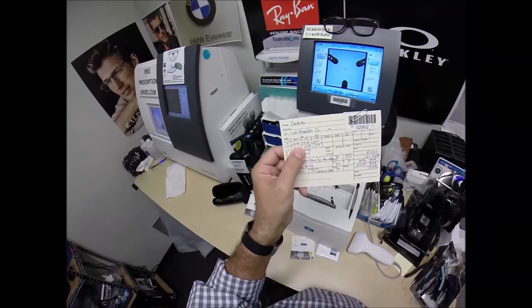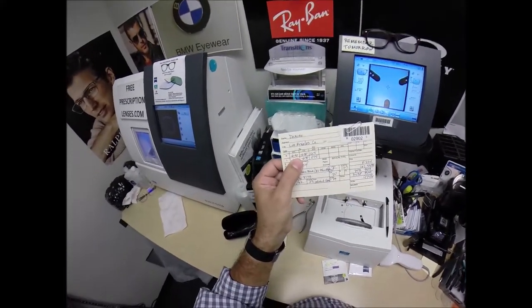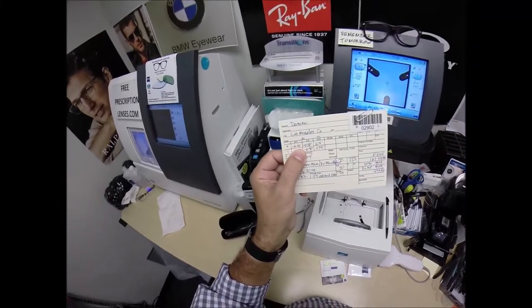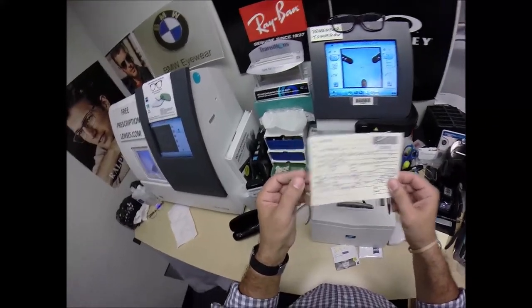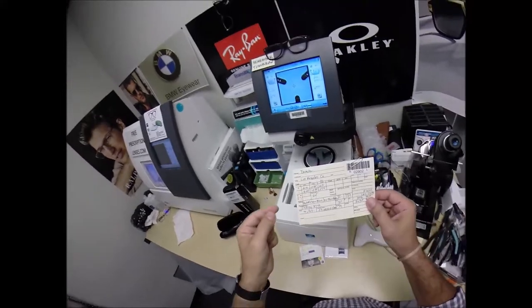The unit of measurement in the optical world is called a diopter, spelled D-I-O-P-T-E-R, starting at 0 and going up in quarter increments: 0.25, 0.50, 0.75, 1. You are on the 24th rung of a ladder. You need 6 full diopters to see far away. You are very nearsighted. With your glasses off, you can see the fingerprint on an ant.